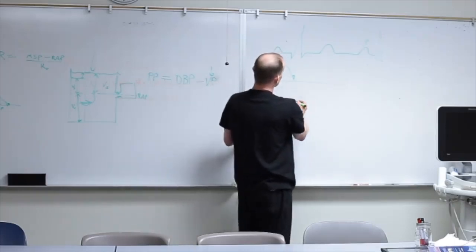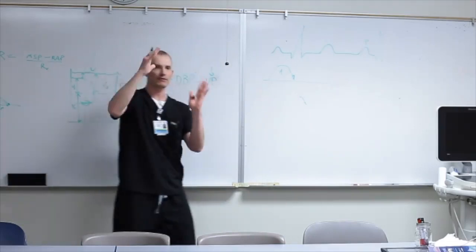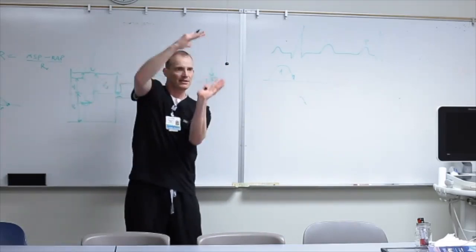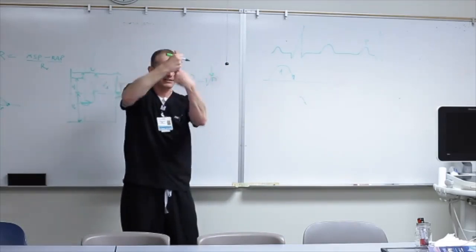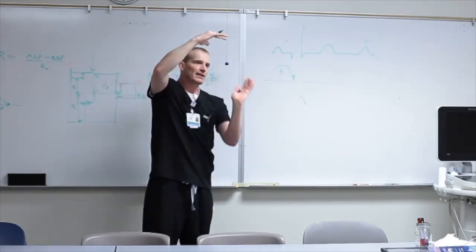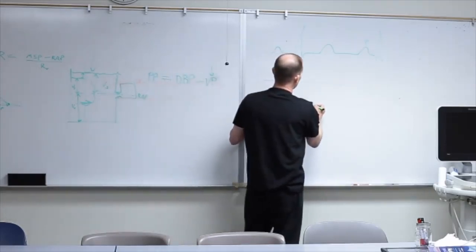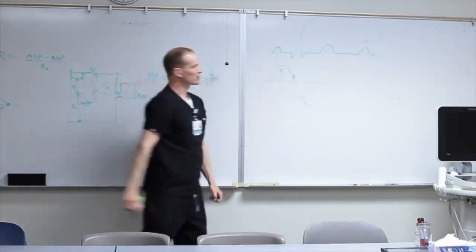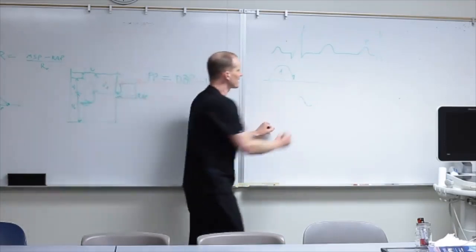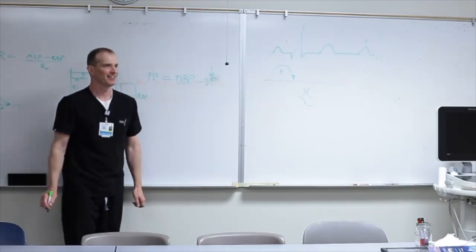We get a little bump where the tricuspid valve closes at the onset of systole while this is relaxing. And so this is atrial relaxation, but when the right ventricle contracts, remember the right ventricle contracts like this, and the left ventricle wrings like this, right? So as the right ventricle comes up, it kind of pulls some blood up with it too, okay? And so we get this downward pressure wave, okay? And this is called the X descent. Does this sound familiar?